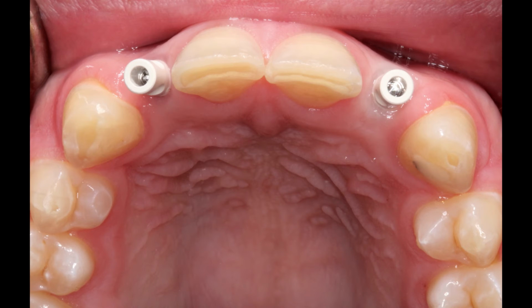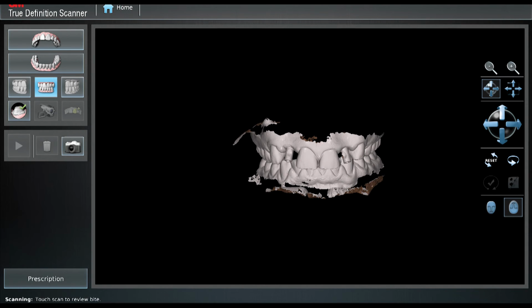Inclusive scanning abutments from Glidewell Direct were threaded into each implant and a digital impression was made. The 3M True Definition Scanner from 3M is a digital impression system consisting of a computer on a mobile cart and a compact, lightweight wand. The scanning wand is a handheld optical device that captures high-resolution video images in real time as the patient is being scanned. The digital technology captures clear and highly accurate impression data in minutes, without the need for traditional impression materials that some patients find inconvenient and messy.